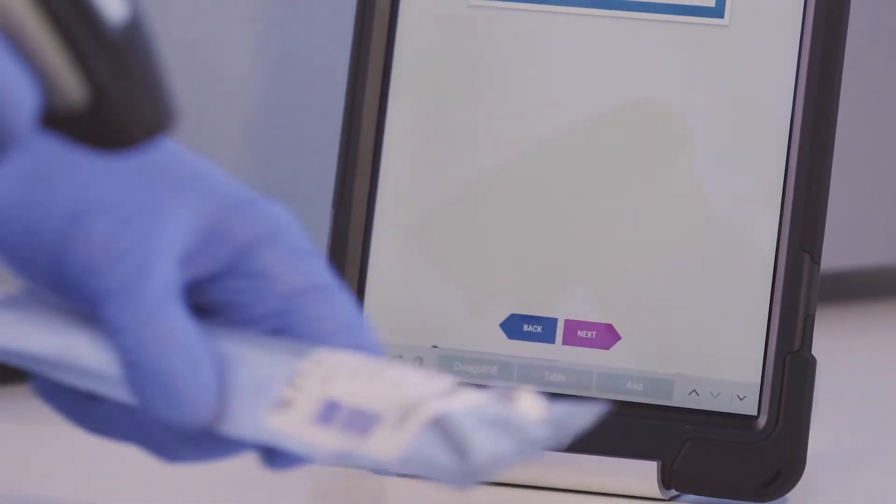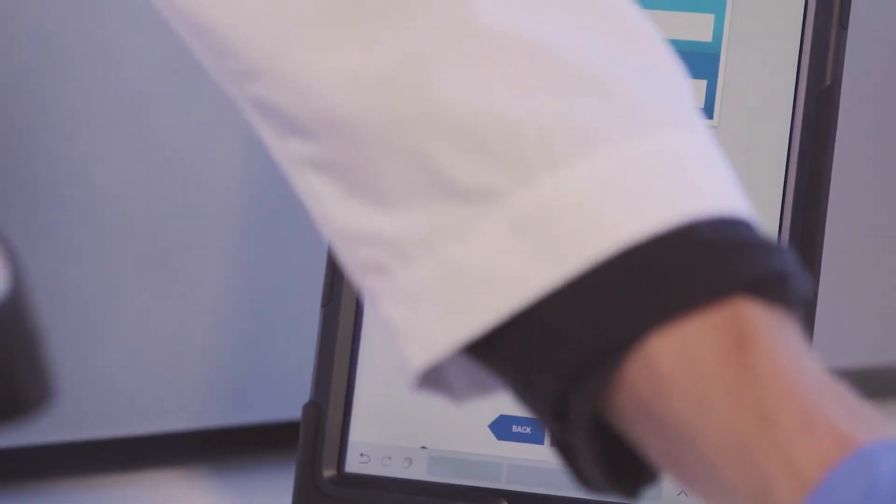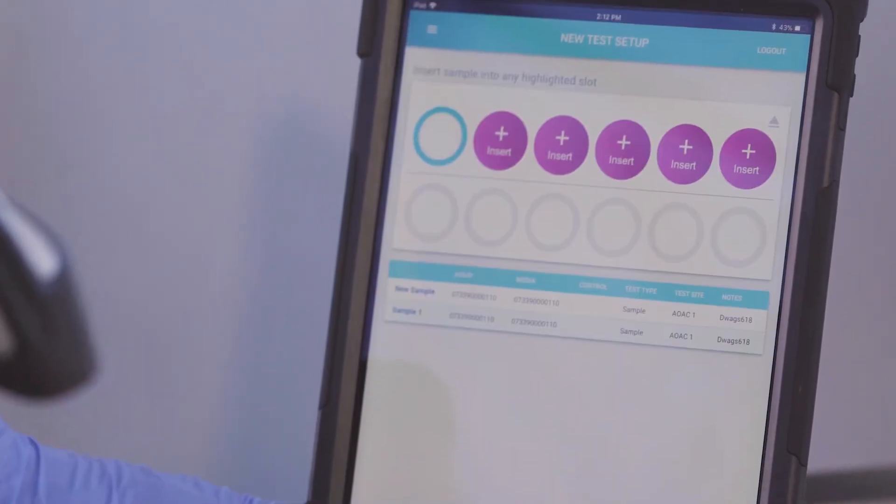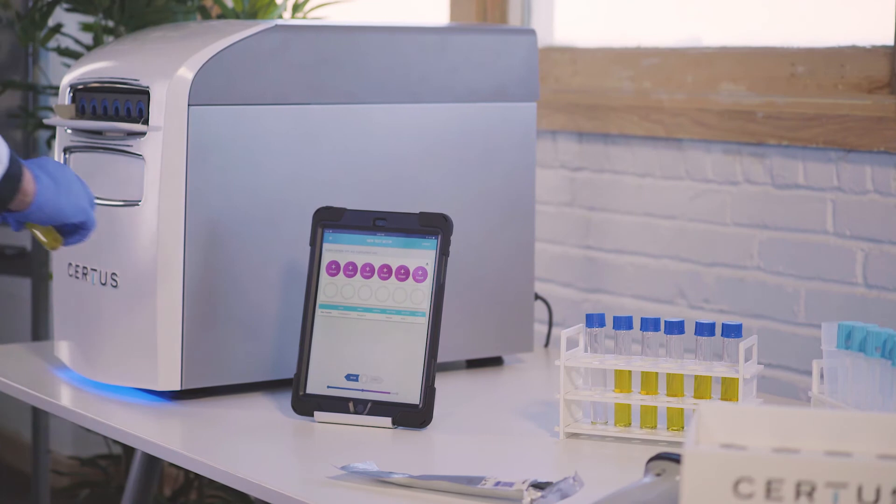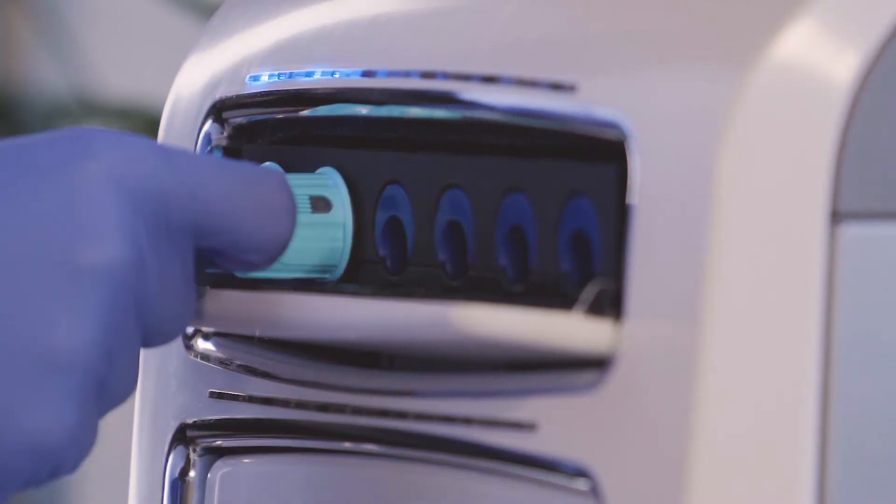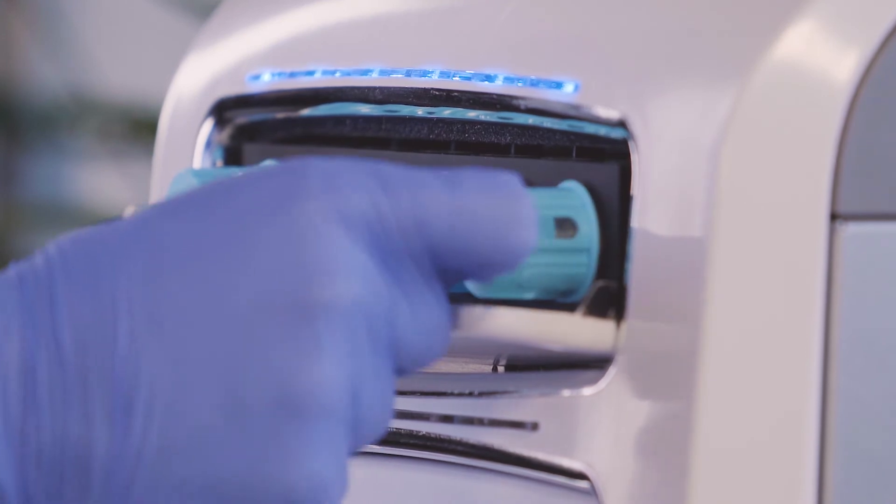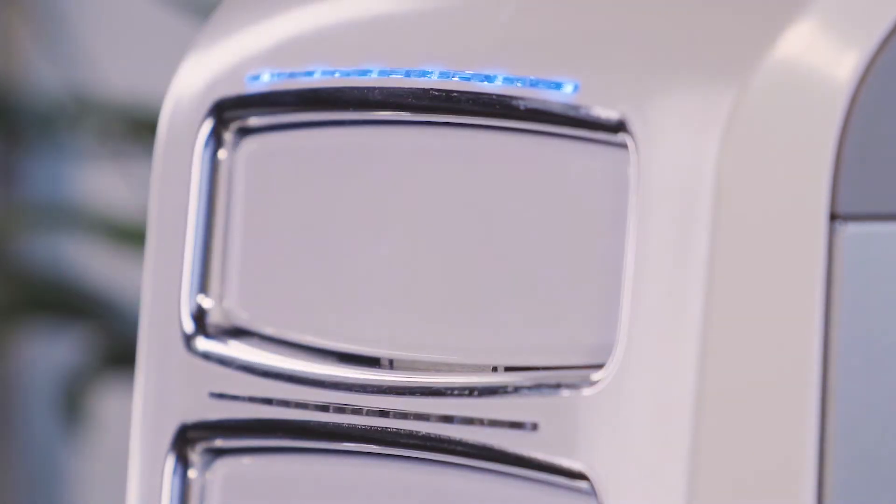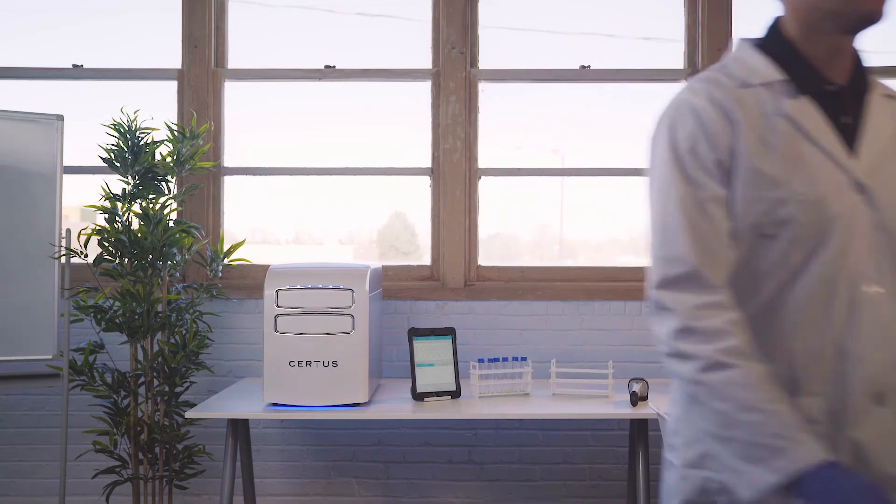When prompted, scan the barcode on the detection tube package or enter the number manually. This enables full quality control traceability for your internal pathogen environmental monitoring program. Insert the tube into the detection unit using any of the available tube slots as indicated on your control pad. The SIRTIS system can test up to 12 samples at a time.